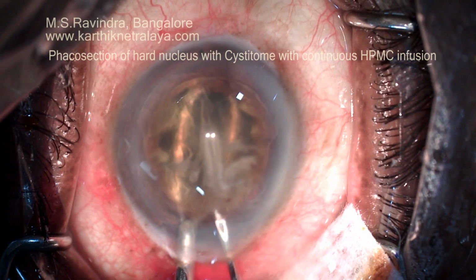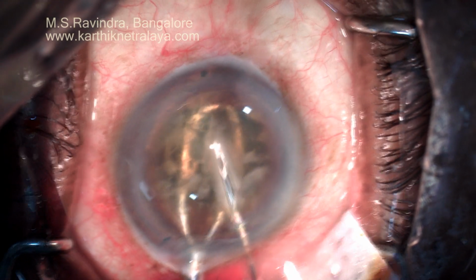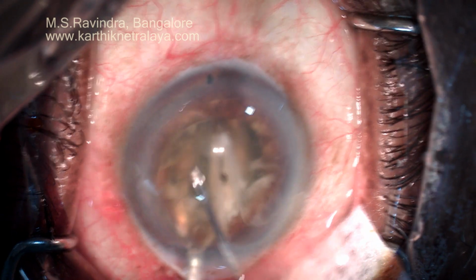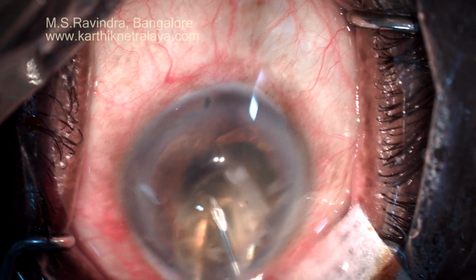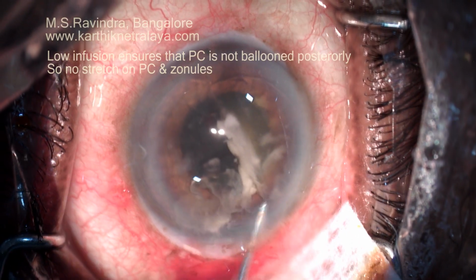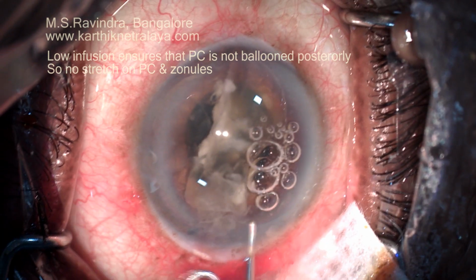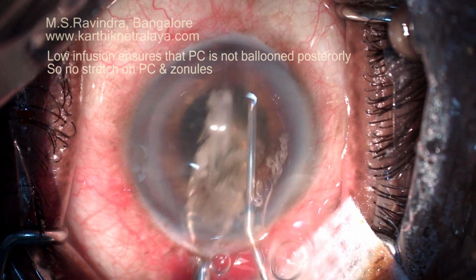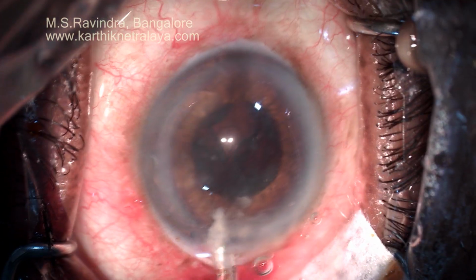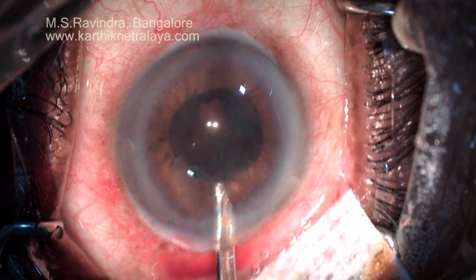Nucleus is hard, so it's bisected with the cystotome with a support behind with mini vectis. The cystotome is continuously injecting visco throughout this procedure. The heminucleus are comfortably extracted from the eye without putting a stretch on the tunnel. It's visco expression. Visco is being injected continuously to minimize damage to the endothelium, which could happen when an object is moving inside the anterior chamber.